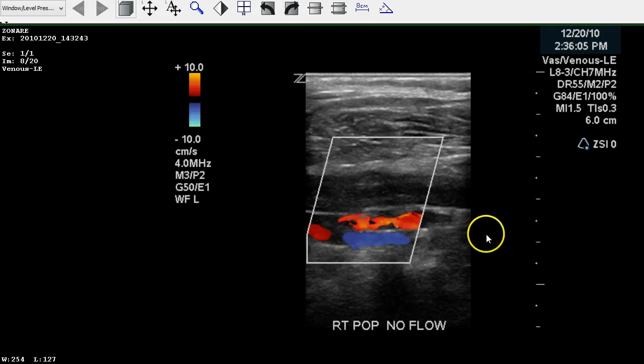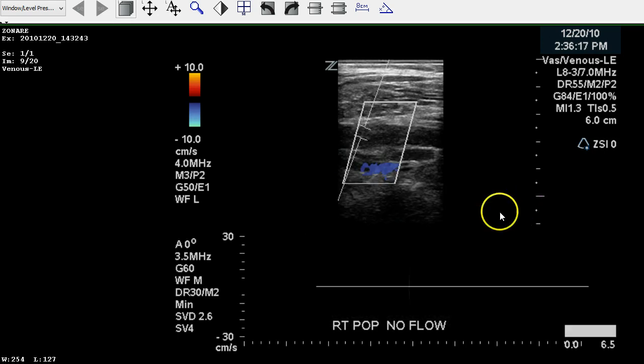We move back to the popliteal, and we notice that there's no color fill within the vein. We see the echogenic material and no blood flow, so that's definitely adding to our conclusion of an occluded vessel. We also put a Doppler in to make sure there's no trickle flow, and we don't see anything along the baseline, so we can safely assume that this vein is fully occluded.